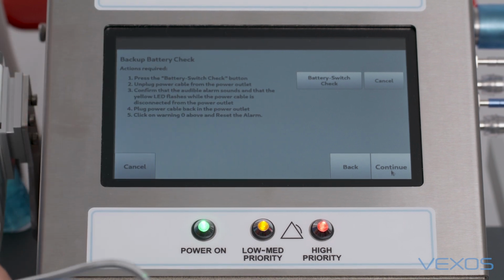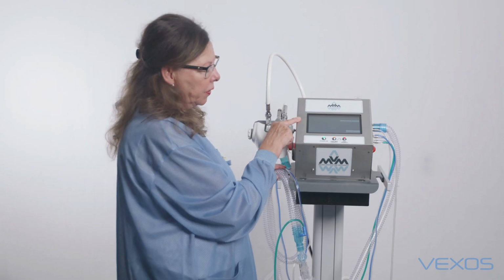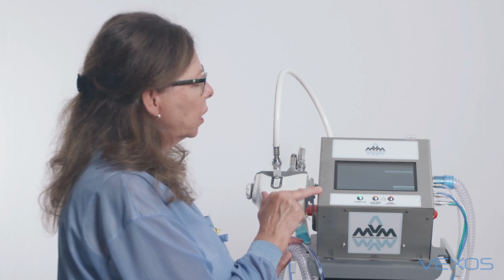The backup battery check is the third of the self-tests, and in this test, it ensures that the battery will take over should the institutional power go down. Unplug the electrical from the electrical outlet.